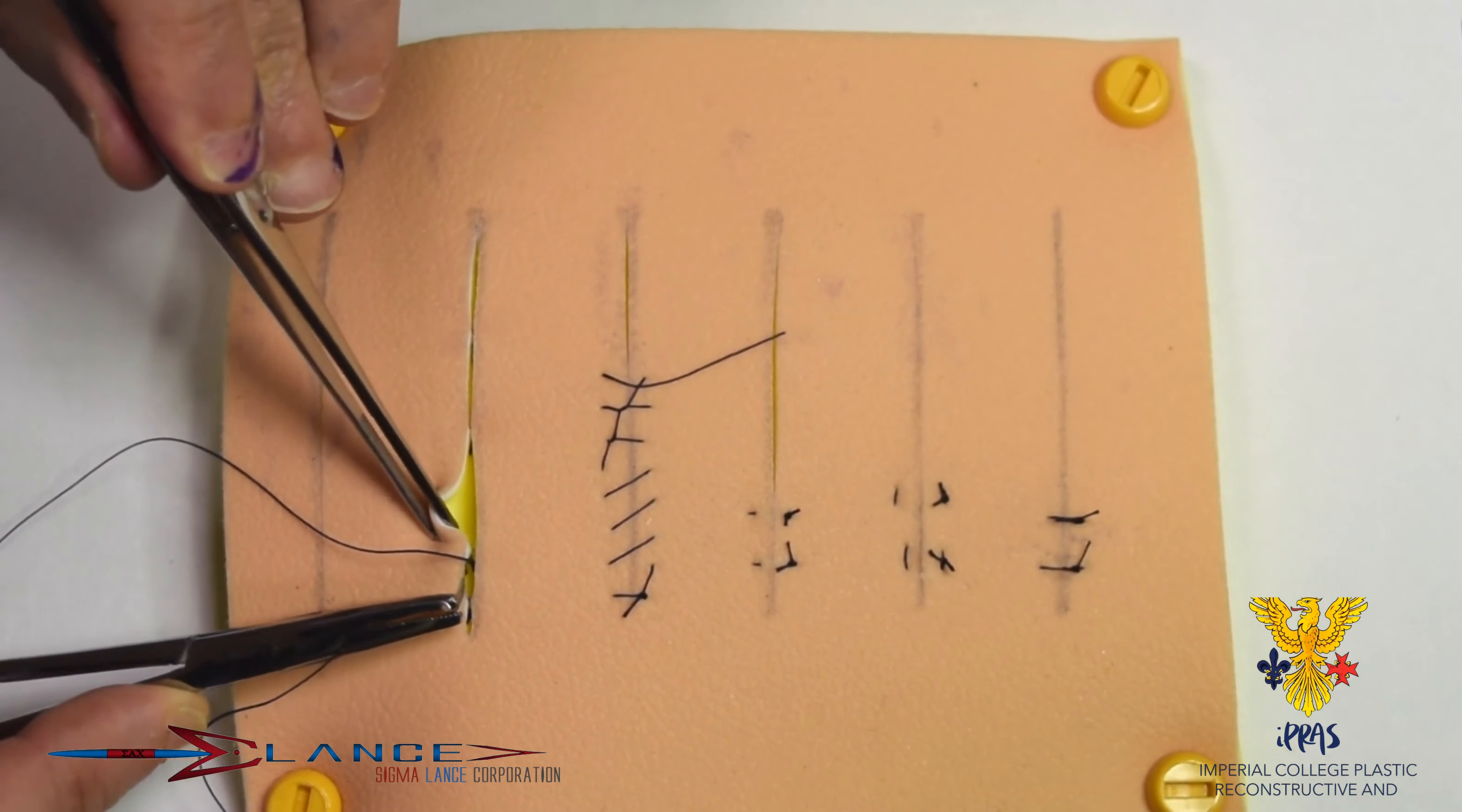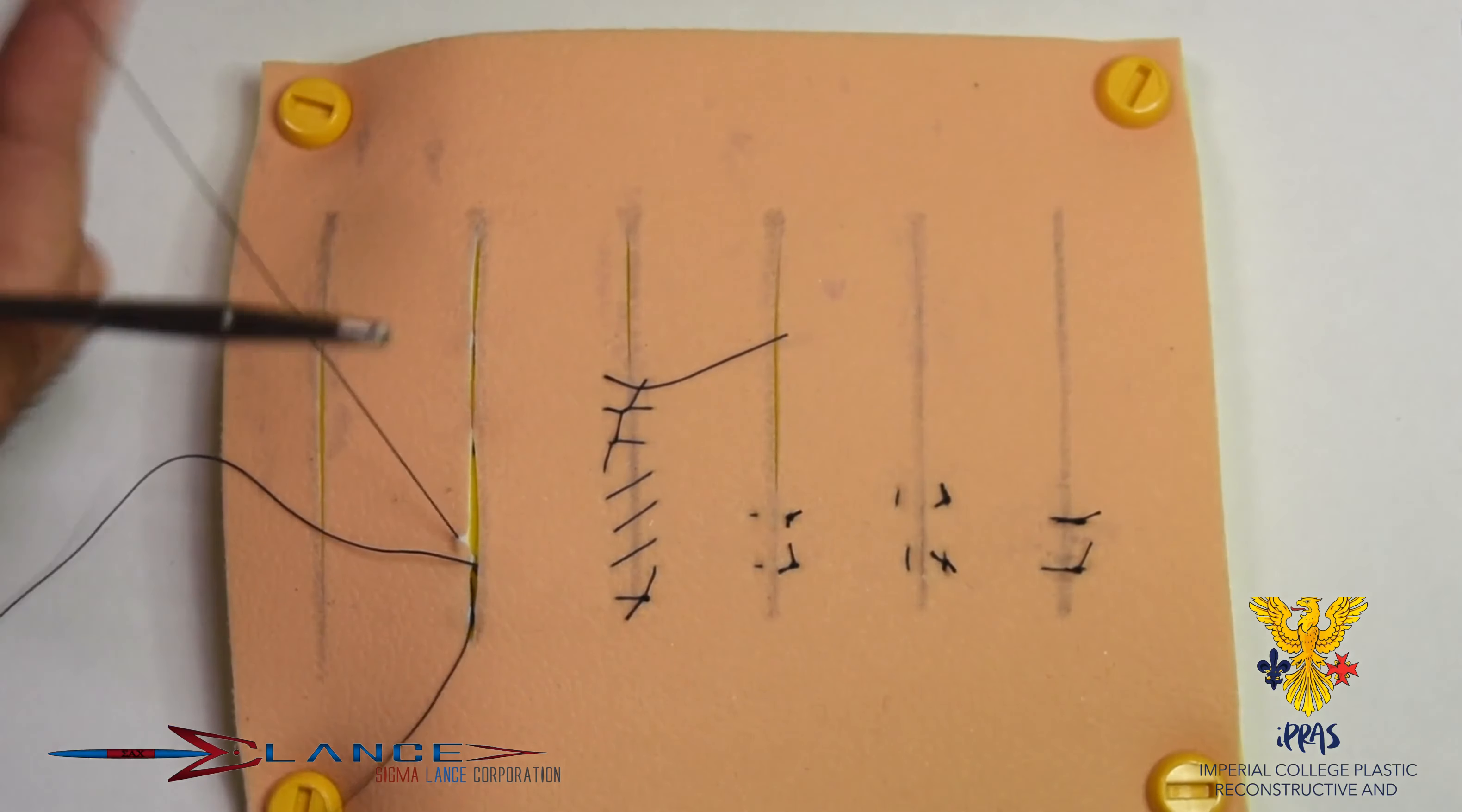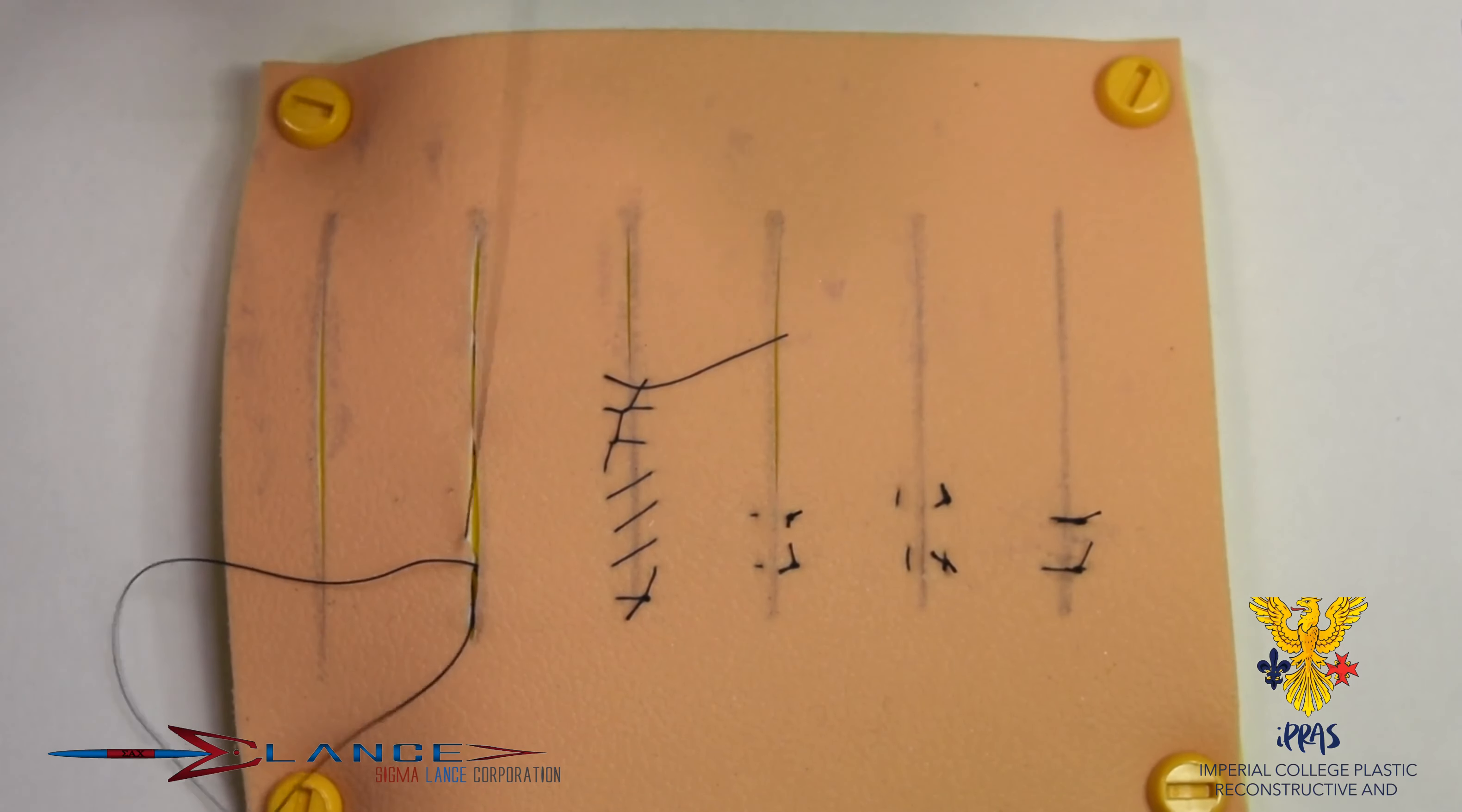So the next bite will sit there, and again, taking equal bites like you have done with the previous one. And again, as you get going, you understand where the bites are.